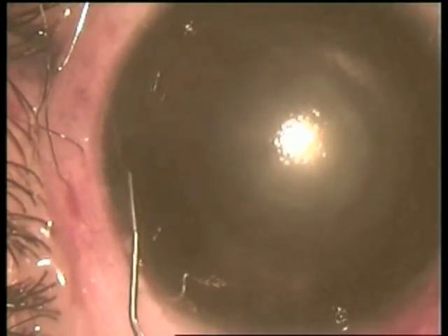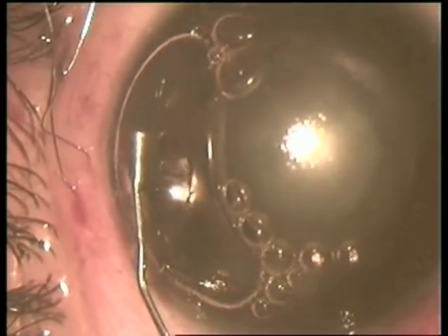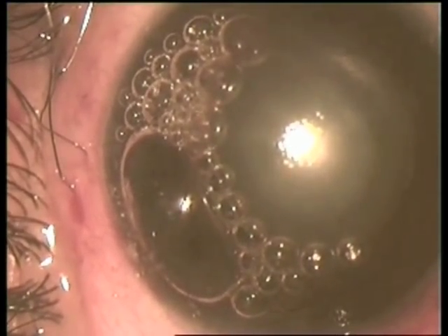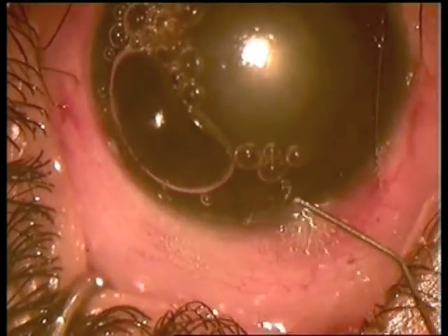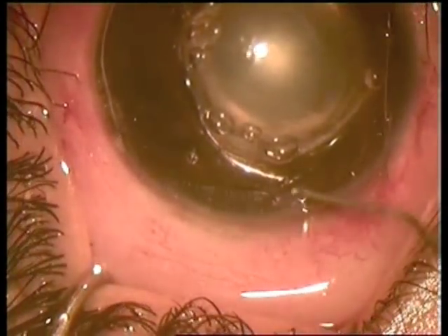Now we inject air, but it can only reach some distance — in other areas the anterior chamber is flat. We also make a pocket section at the upper limbus with two more iridotomies, then inject air again.